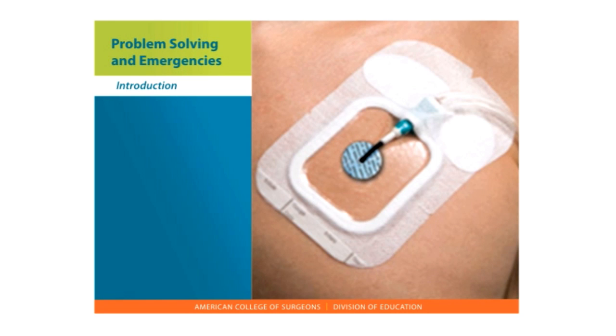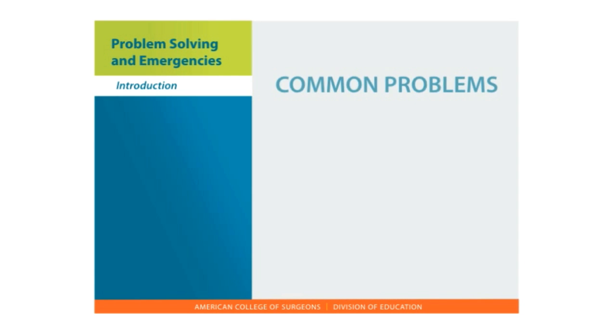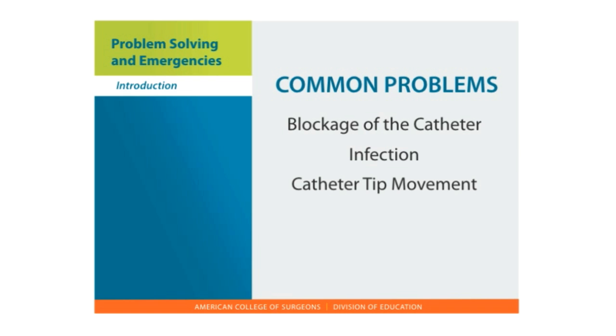There are common problems which can occur with any CVAD. Knowing what to watch out for will help you quickly manage these problems with your healthcare team. The most common problems include blockage of the catheter, infection, catheter tip movement, and catheter breaks.